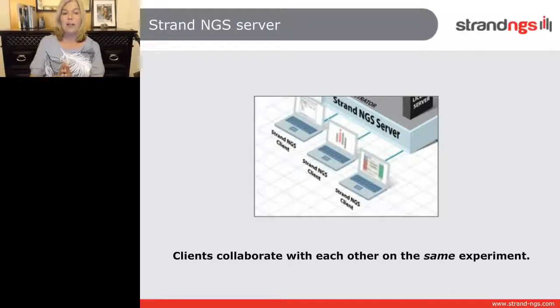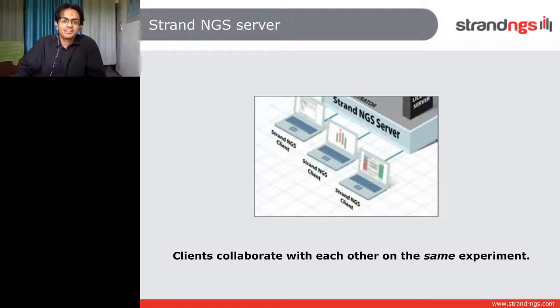Here's our next question. The part about zygosity is interesting. Could you explain it again? Sure, zygosity, for sure. Let me just navigate to that slide.